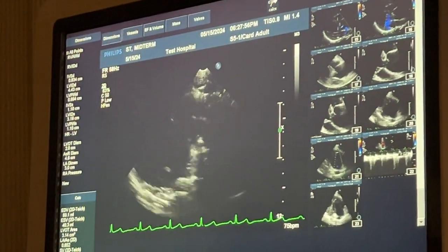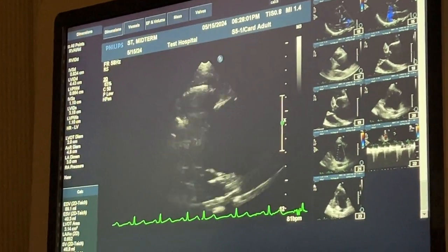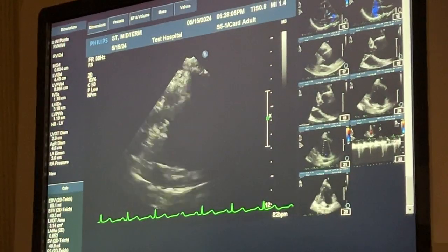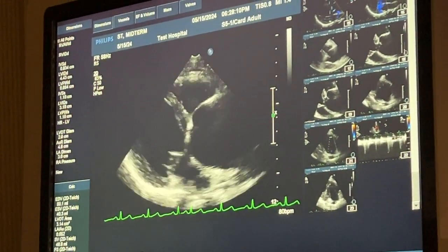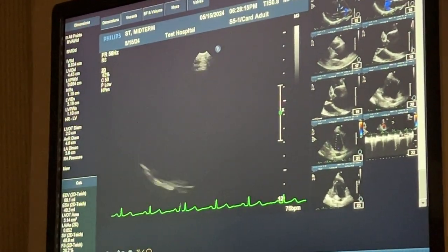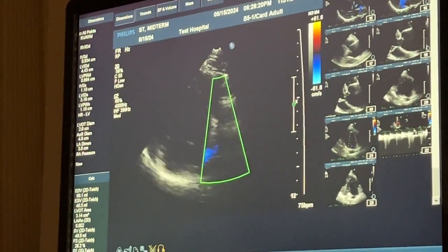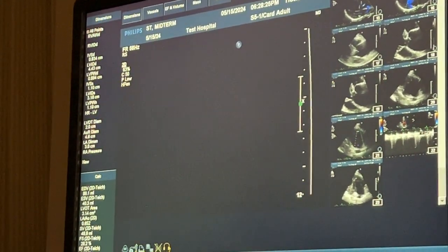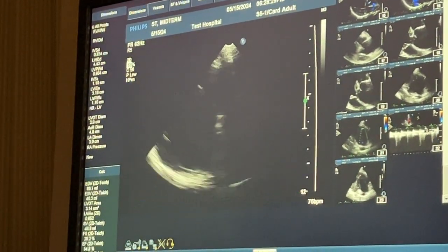I think I'm getting it. Can I have you tilt toward me just a little bit more? Yeah, like a steep face. All right, I'm gonna let color try to be my guide because I think this is it right here. Yes. See that blue in systole? Flash, that's where we're at. So I'm gonna see if I can get it any better, but I know I am there.